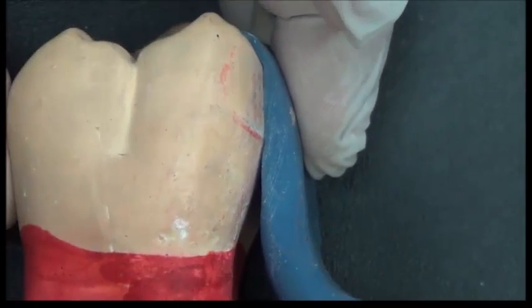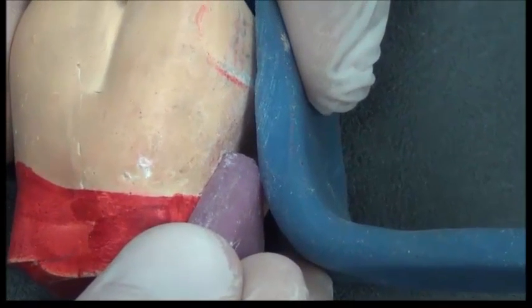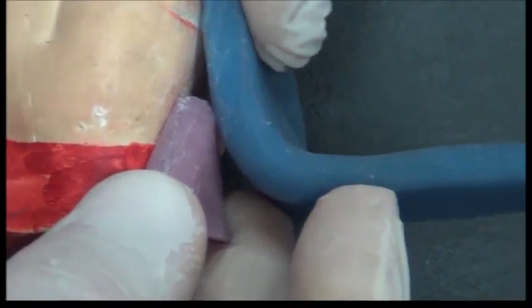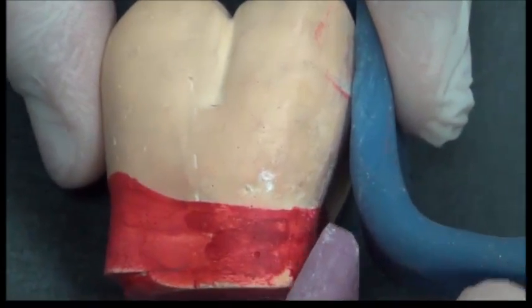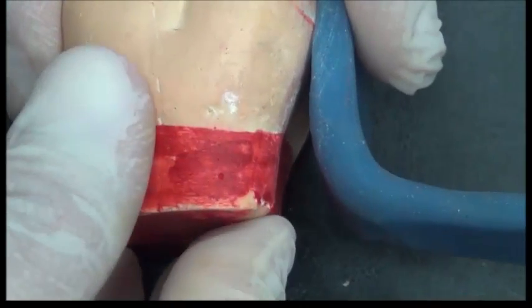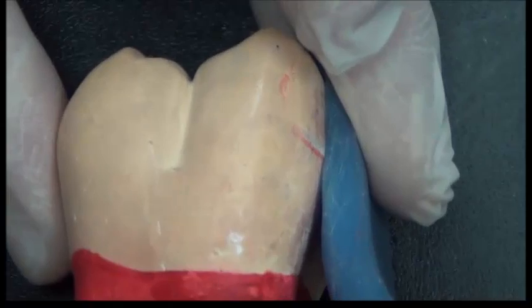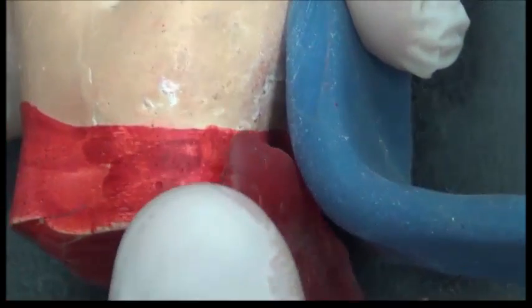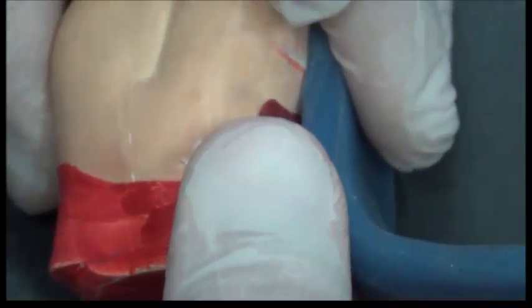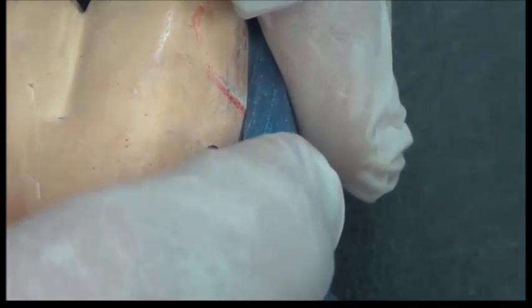The gingiva is in this area in the form of a papilla. And if the metal component moves and touches this papilla, it will traumatize it. Traumatization of the gingival collar around the tooth would cause later periodontal problems. So we need to add a blockout. We add a blockout in the form of wax. Wax is added beneath the metal to make sure that this metal part close to the gingiva does not touch the tooth, and it's protecting the gingiva.